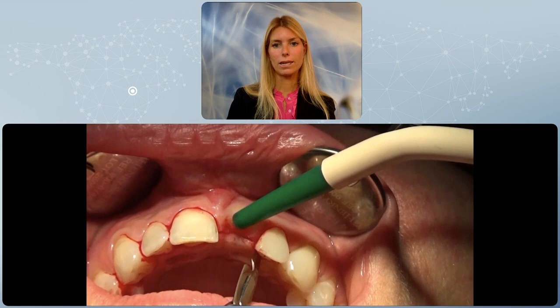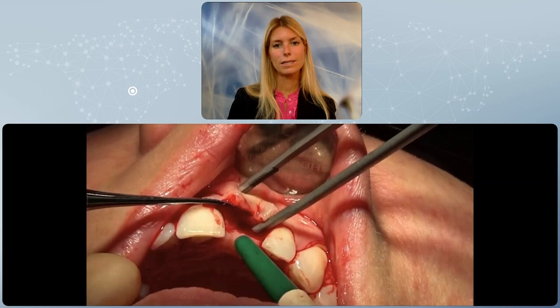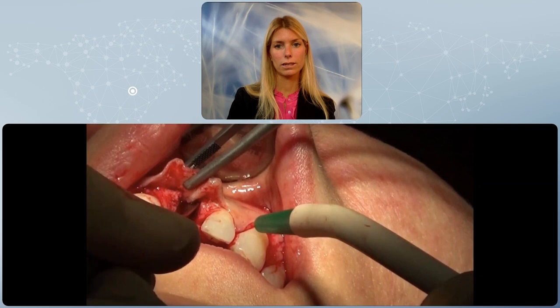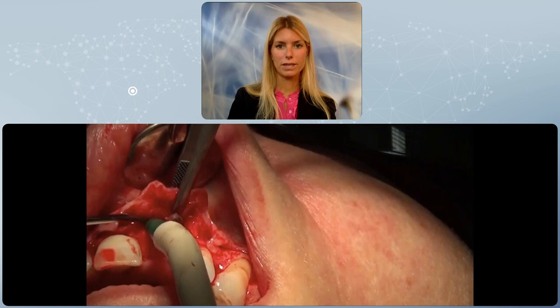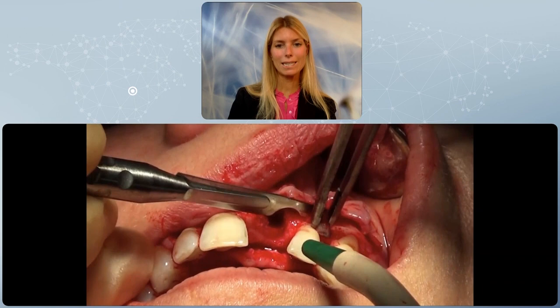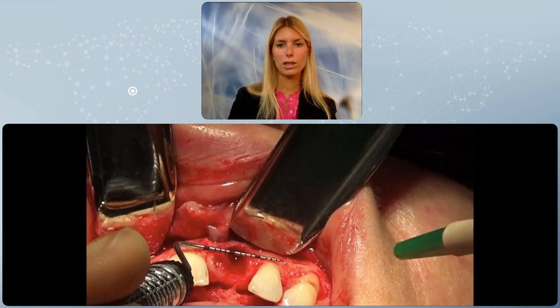So the area is then reflected with a very small periosteal elevator, and this is the scenario that we see 6 to 8 weeks after tooth extraction when nothing is performed in that moment. So the tooth is extracted, left to heal spontaneously, and this is what we find, which is not surprising, when the tissues are elevated. We perform a full thickness flap elevation, we clean the sulcus very well, and now we have some proper bone that is waiting to have the implant positioned, which will be positioned in the right 3D positioning, as I was mentioning before.